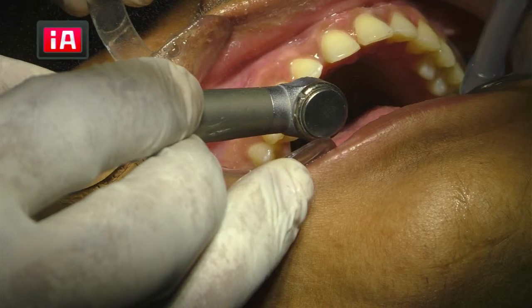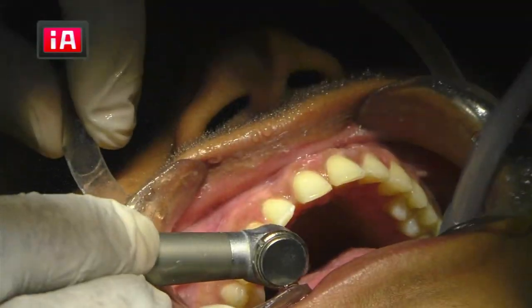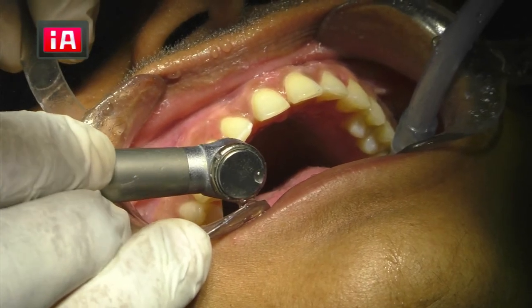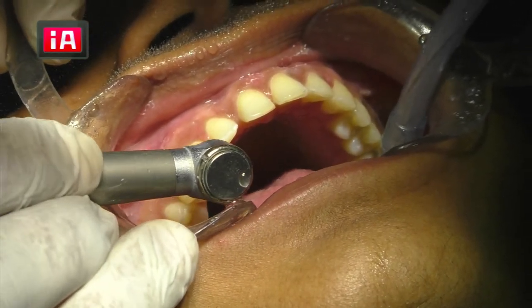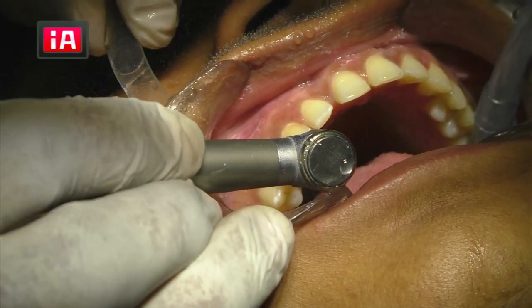The major thing is, you have to understand where you have given a margin, otherwise the lab person will not understand. So they should understand. Okay.